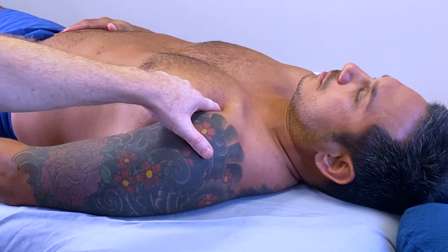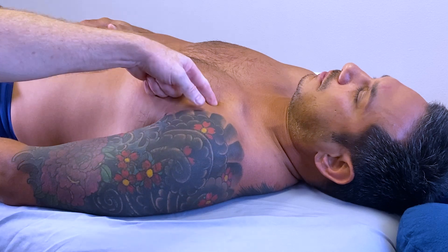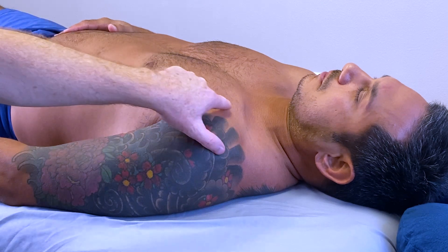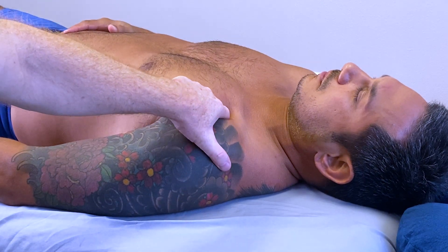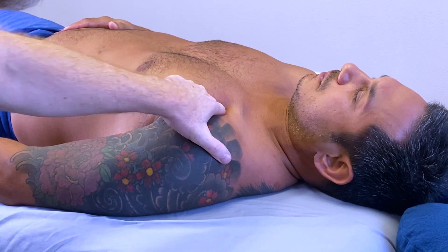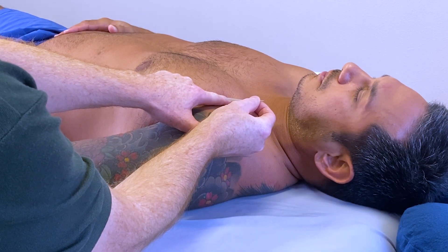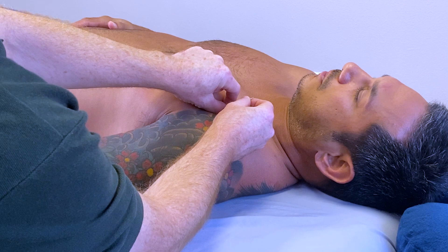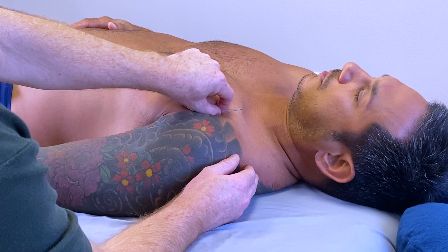Palpating for taut bands in the muscle can be helpful to gauge tension. Here I am palpating the clavicular head and assessing for tension. I can also push from inferior to superior, or superior to inferior, to feel which offers the most resistance. I can then advance the needle across the fibers in that direction, taking care to place the needle at the same angle as the palpation and not change the angle deeper towards the ribcage.